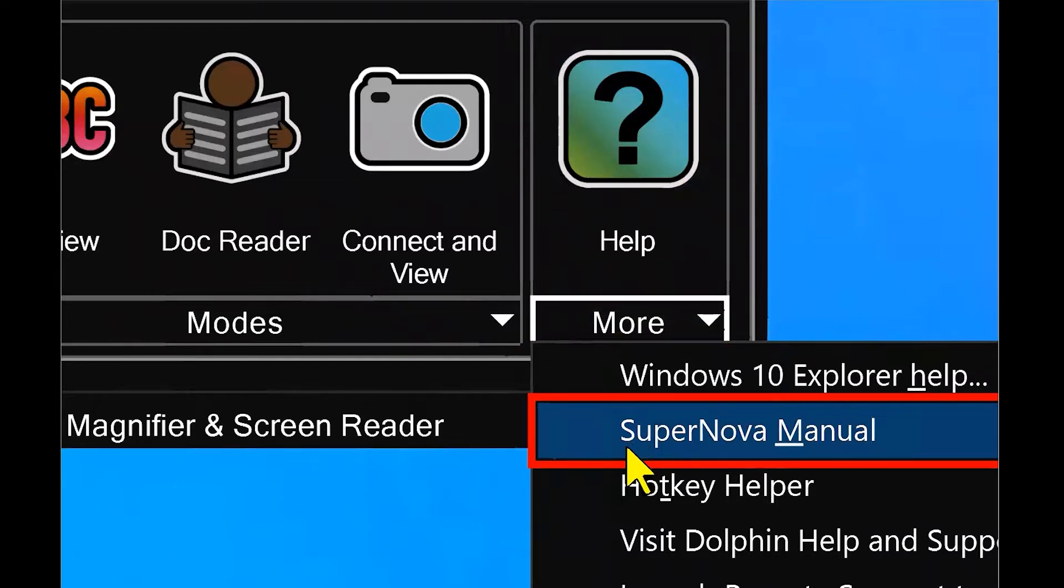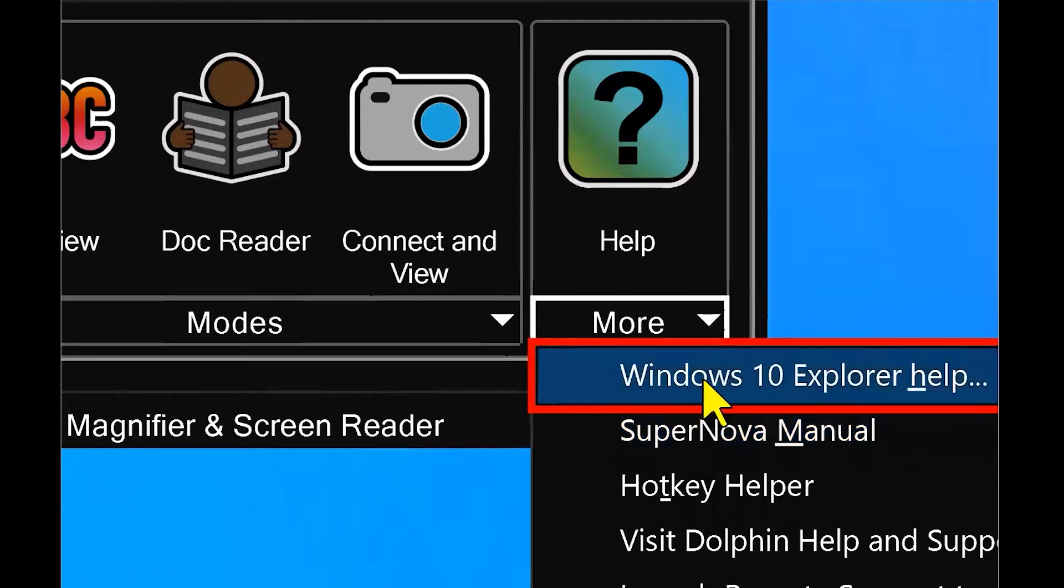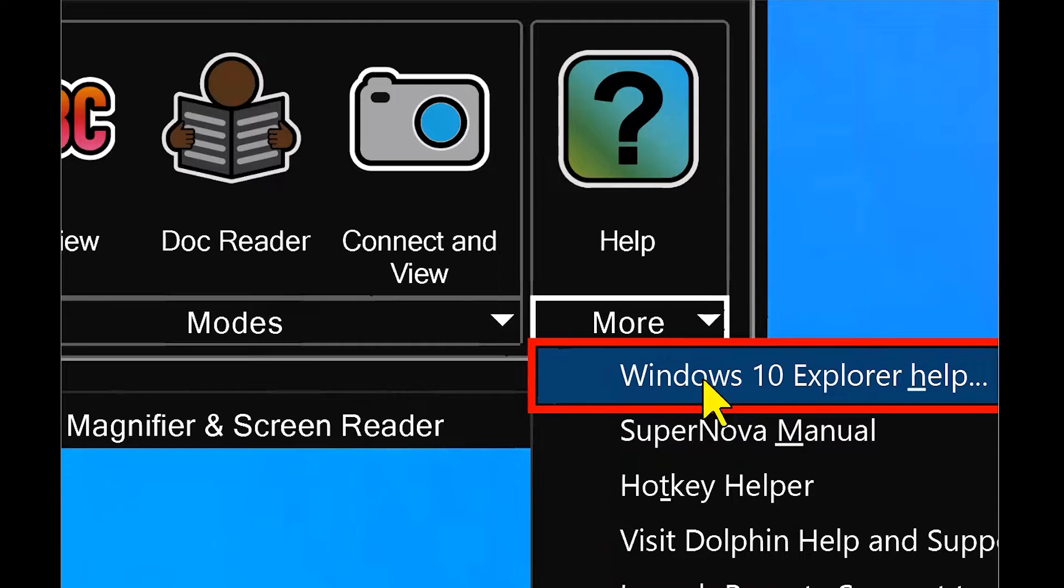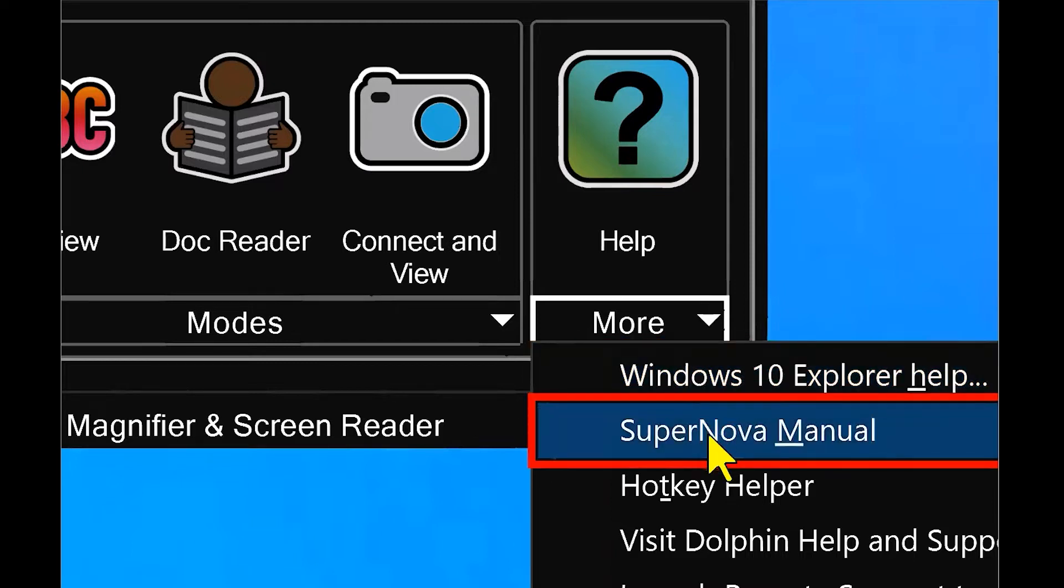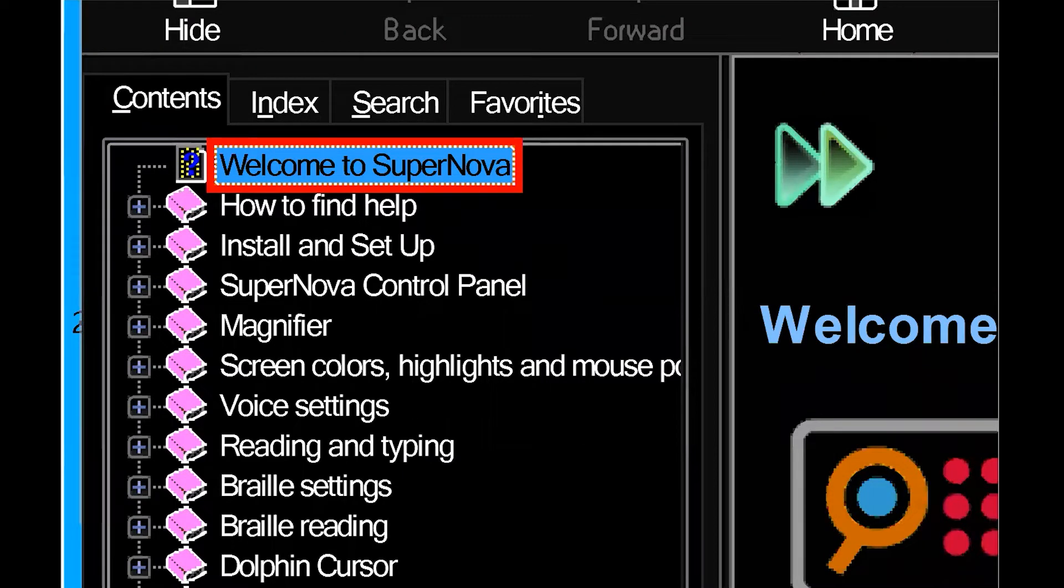The first one that we're going to take a peek at is your SuperNova manual. That's the second option down. You'll notice the first option will change depending on what application you're working with. So I'm not currently in an application, so it's going to show you help for Windows 10. But you'll notice as we go further, when I open up an application that will change for help for that application specifically.